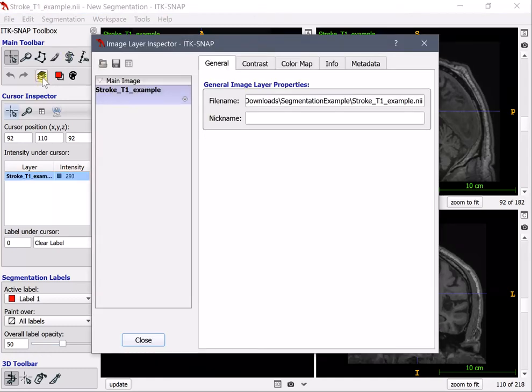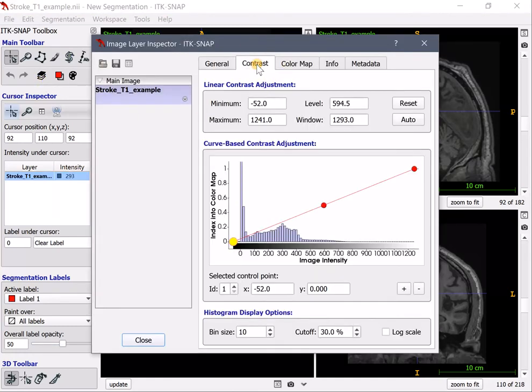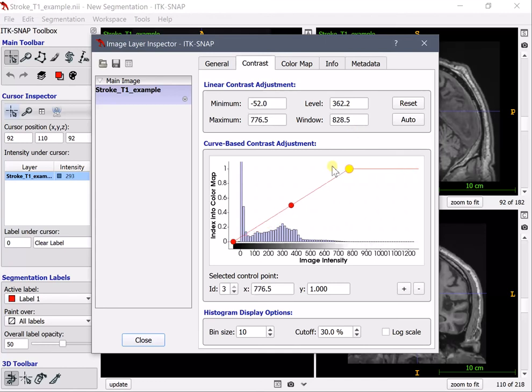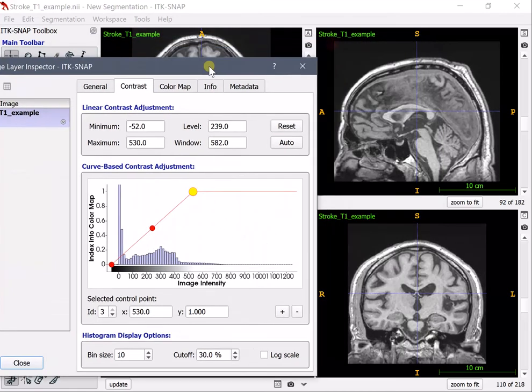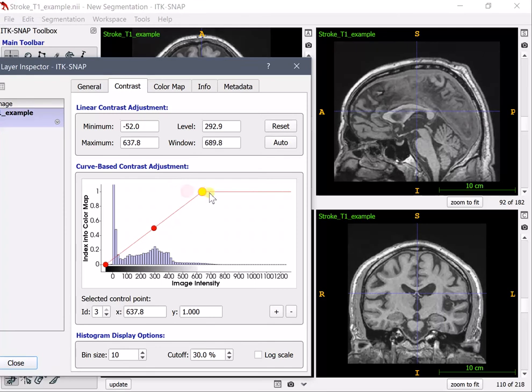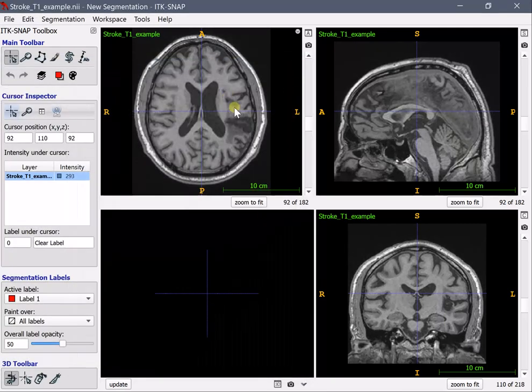You can do it by going here and then going into contrast and then just dragging this plot here to cover the whole histogram. Now everything is a little brighter.